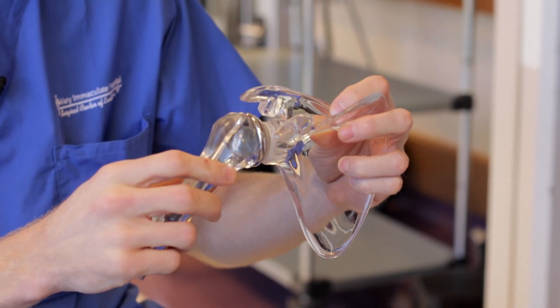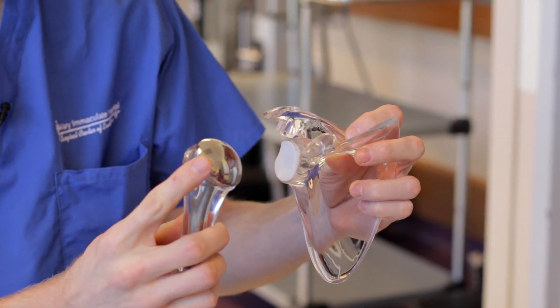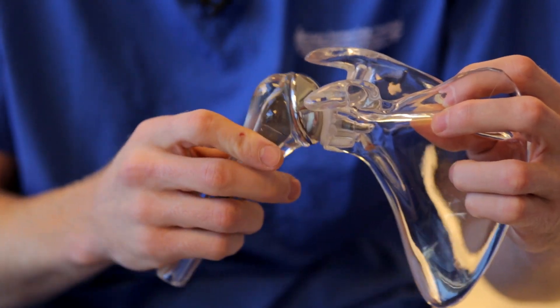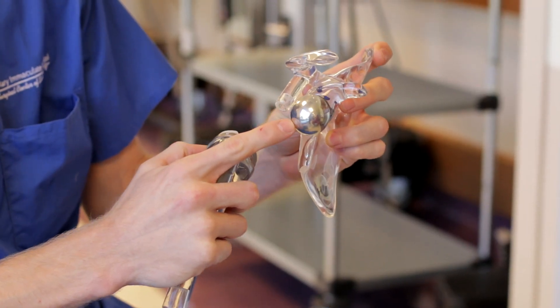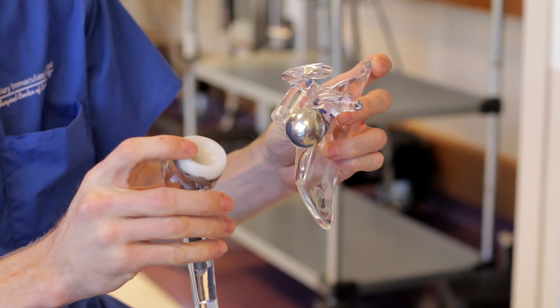In a standard shoulder replacement, we replace the ball part of the joint with a ball and the socket with the socket, and the geometry of the shoulder is similar. The reverse shoulder replacement puts a ball-type component where the socket was and a socket-type component where the ball was.